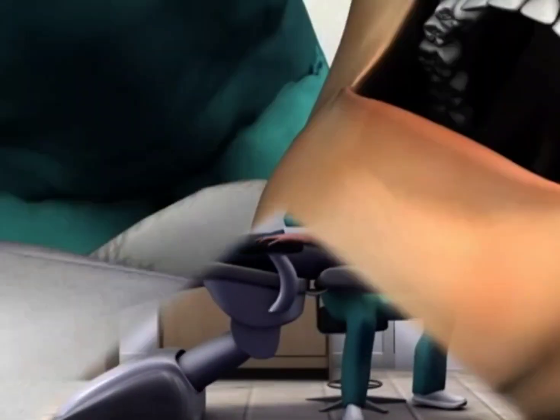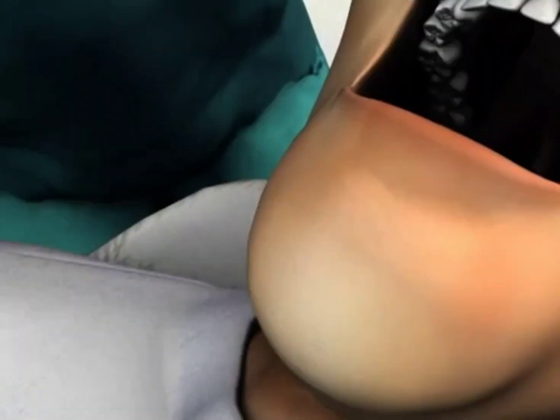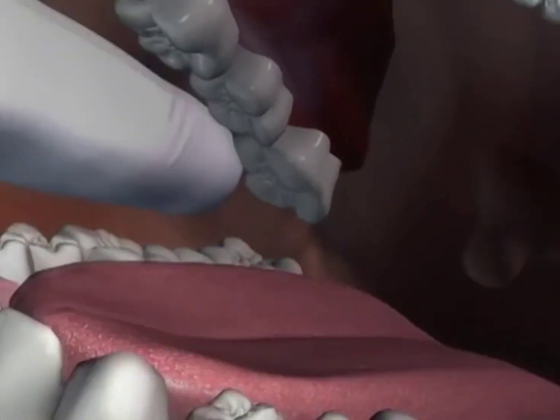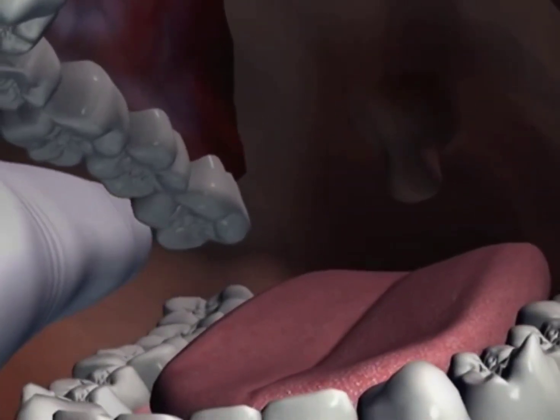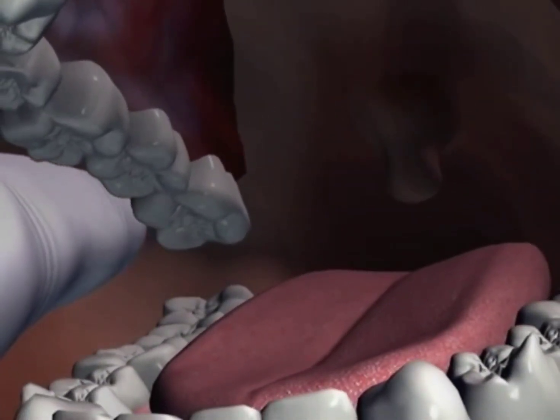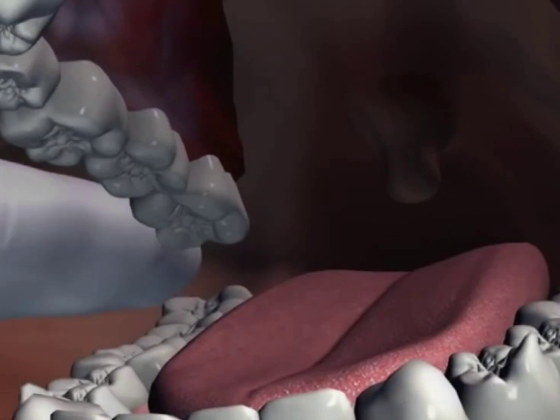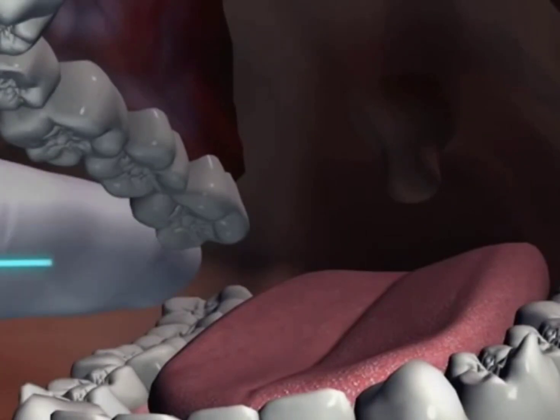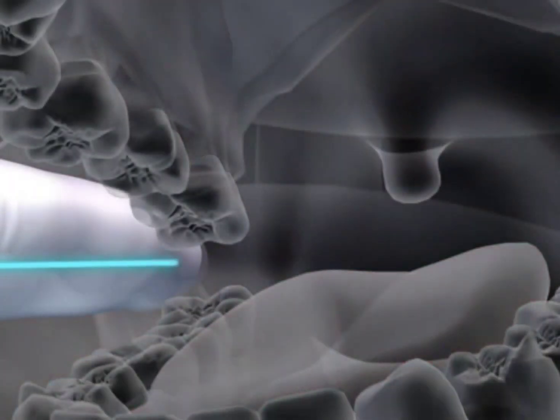Our tour begins with the patient's mouth opened widely and the patient's head turned slightly toward the operator. The operator's finger palpates the greatest depth of the coronoid notch and moves the finger laterally to make the tissue taut. The finger is held parallel to the mandibular occlusal plane so that the middle of the finger coincides with the deepest part of the coronoid notch.